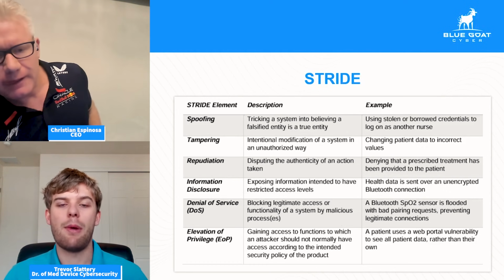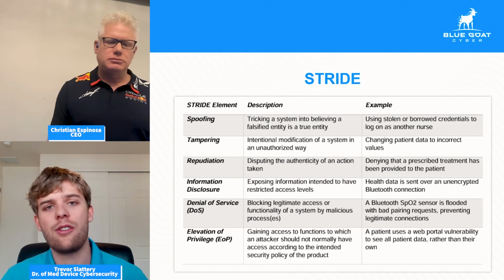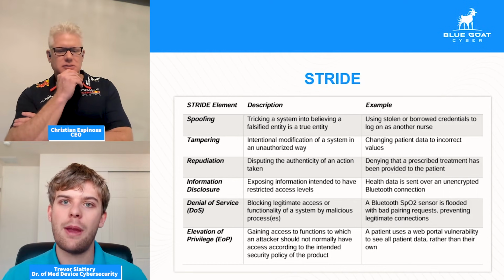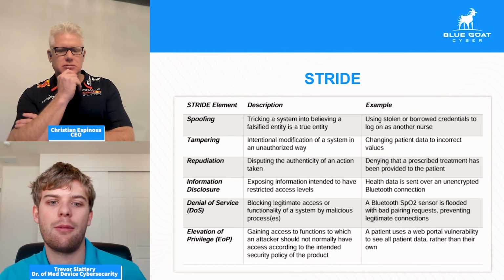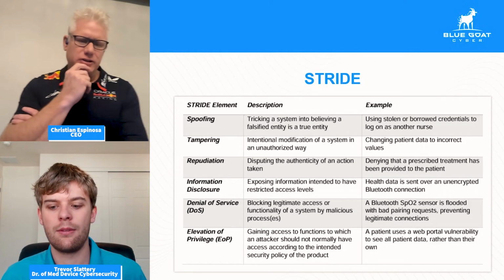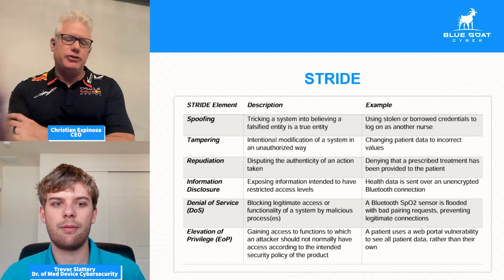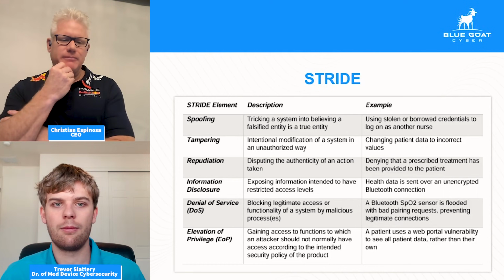Tampering is going to be modification. If we get into that database and we change usernames and passwords so that they are no longer the same, only you know those, now legitimate users can't access their accounts, that would be tampering with information. And so we would explore what different areas you can get in and make changes there. And that tampering is a big concern for medical devices, because we could tamper with the data, with an in vitro diagnostic system, and cause it to give out a false analysis of a result, really, right?